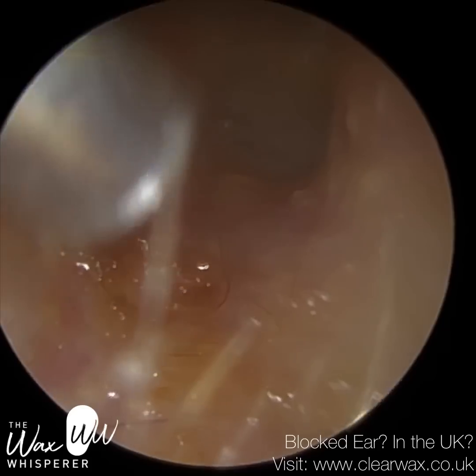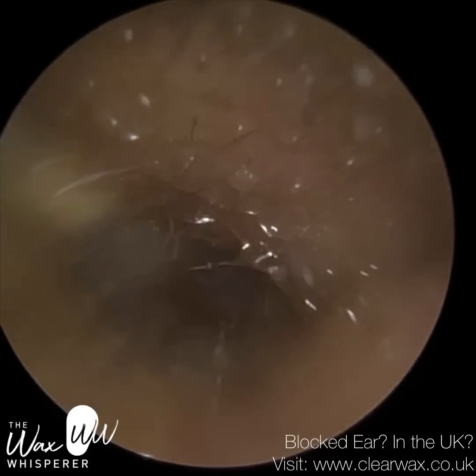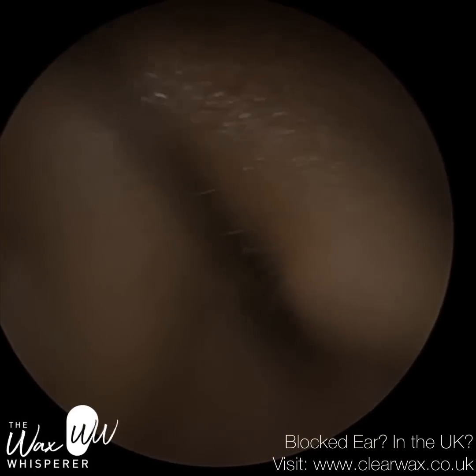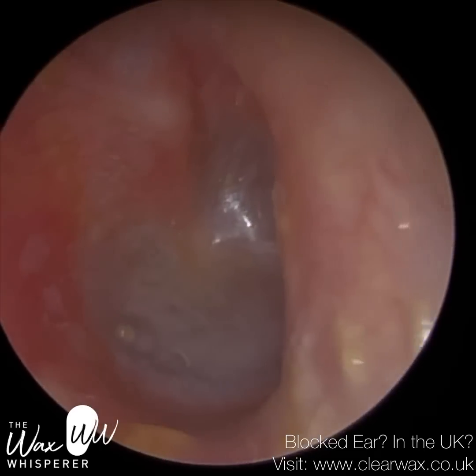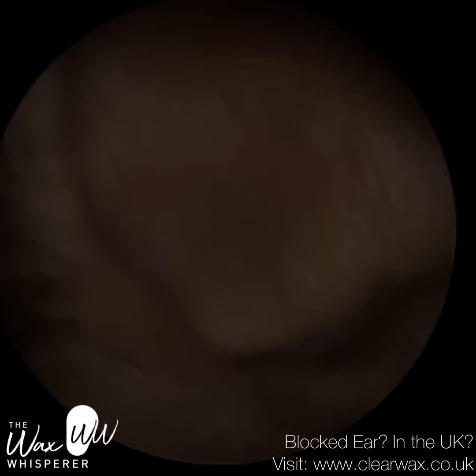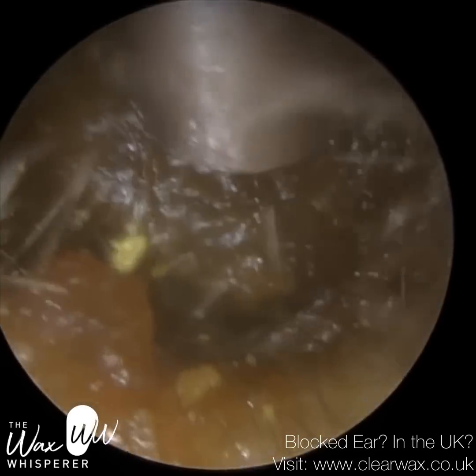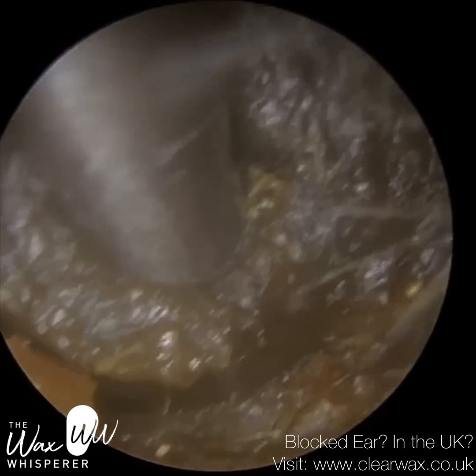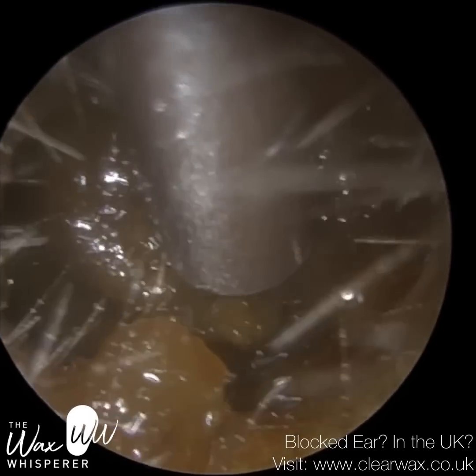I'm just using the fine end suction probe because we don't need to use the full suction probe given the ears are clear, and we're working very close to the canal wall, so the fine end gives me more precision. And there's a little bit around the edge at the top, just going to leave that. And you can see also the skin that lines the eardrum. So the outer membrane of the eardrum is made with the same skin that lines the inner 2/3 of the ear canal. It's the epidermis layer of skin, the outermost layer of skin.